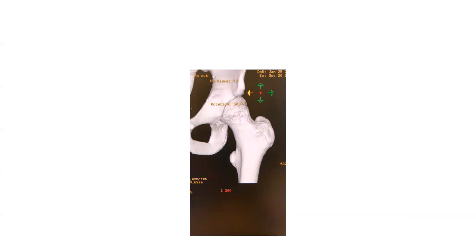I don't expect you to know this, okay? This is orthopedics. You're all eventually going to learn more and more orthopedics as you go along. But our residents know to order an X-ray in internal rotation. But what study might be more accurate in finding a femoral neck fracture? A CAT scan, right? Higher resolution.